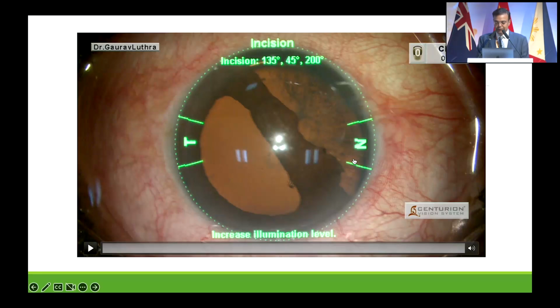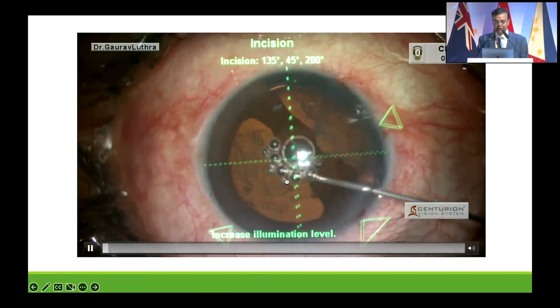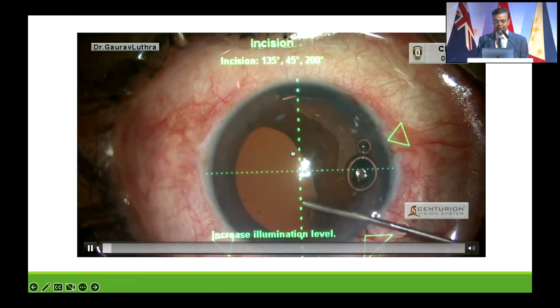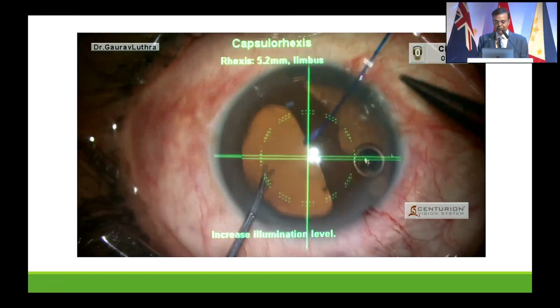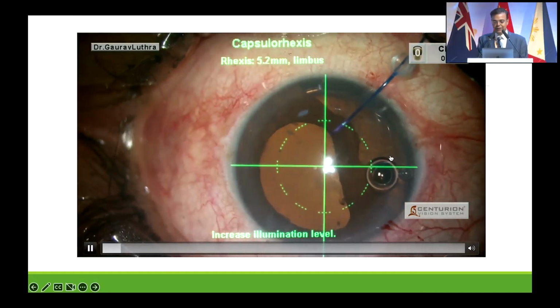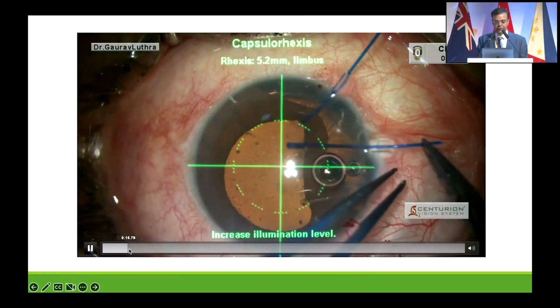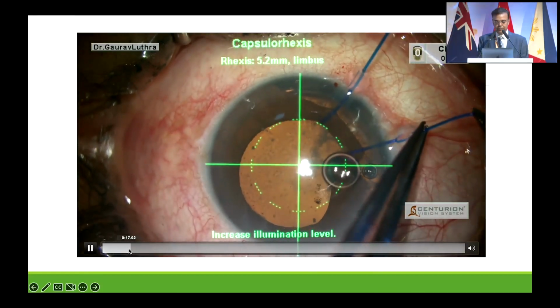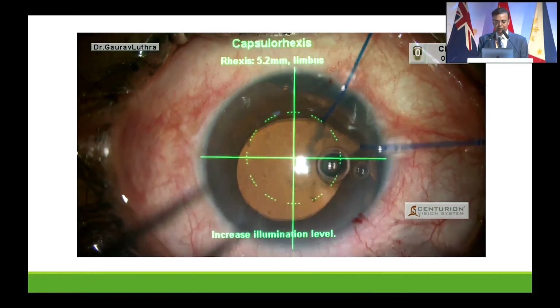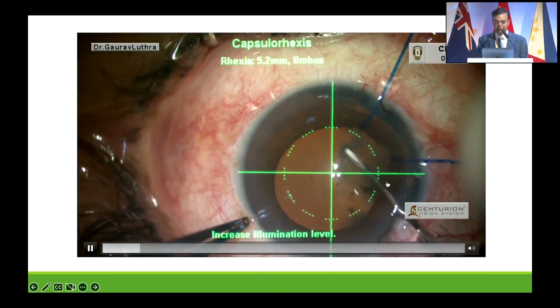Going to a third case, and here there's a big iridodialysis, and I'll close with this. There's a big iridodialysis, again a traumatic cataract with a firecracker injury, and we had to do a dialysis repair and a cataract surgery, and the lens was slightly subluxated as well over here. So putting iris hooks. This is important during cataract surgery to ensure that the pupil stays open, otherwise the iris will start going into the phaco probe.